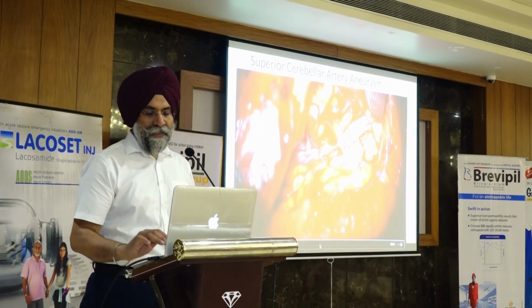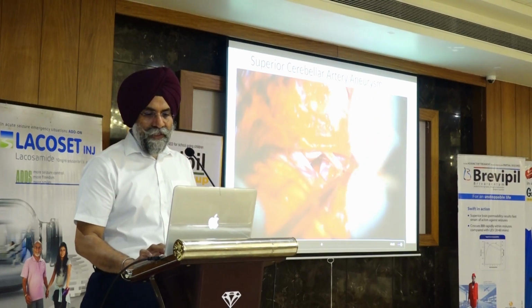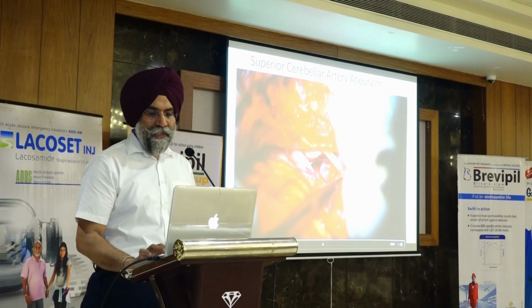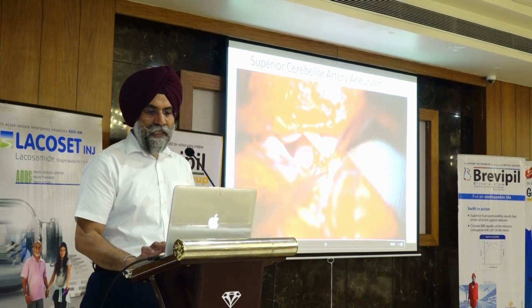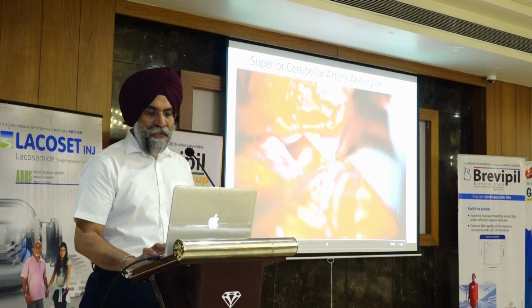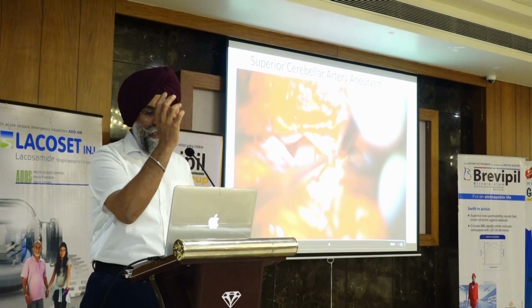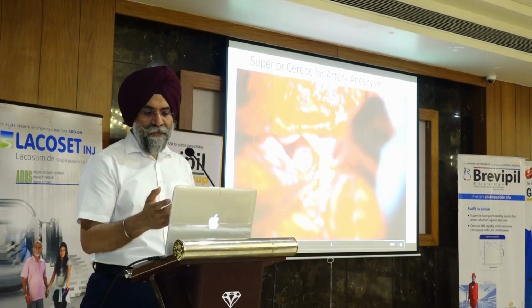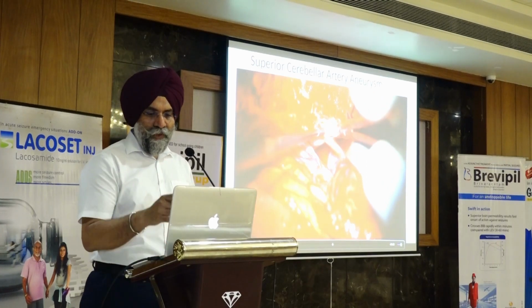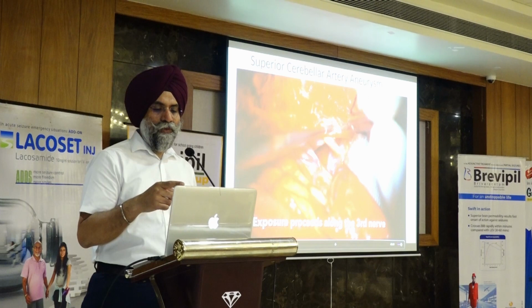Now this is a vascular surgery through the cavernous sinus, same approach. So this is the third nerve, which we are just dissecting off. This whole area is basically the lateral wall of the cavernous sinus. So this is the aneurysm. To get a proximal control, very thin wall, maybe around 6 to 7 millimeters of aneurysm.